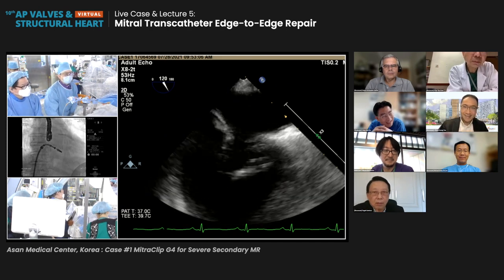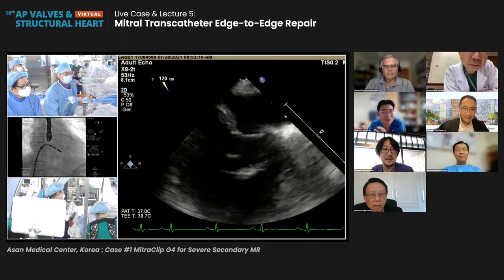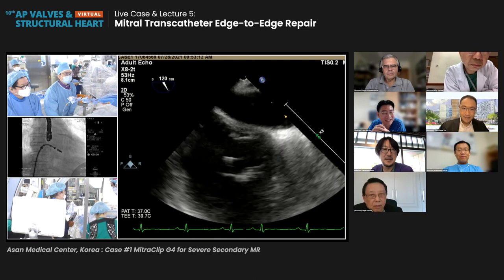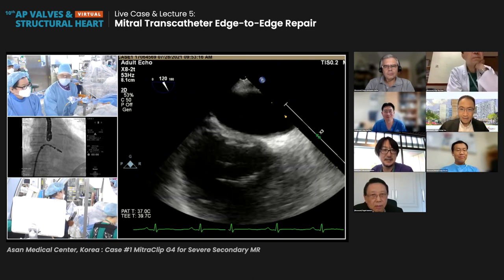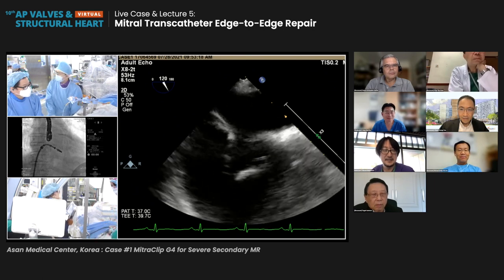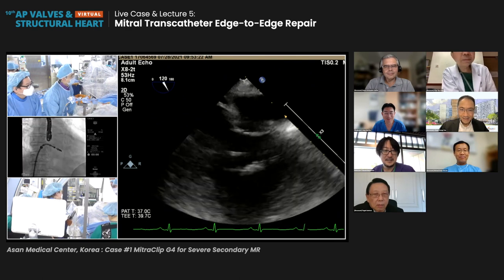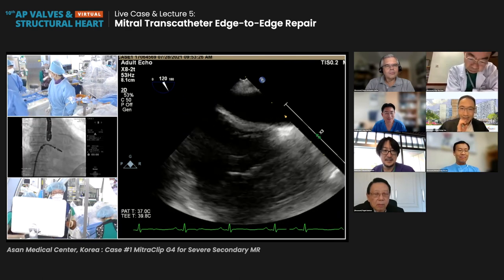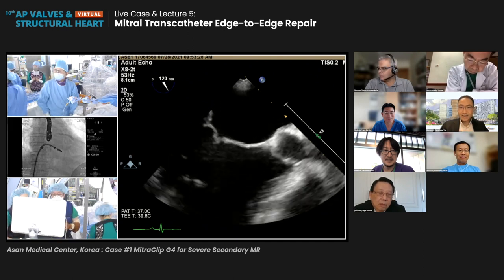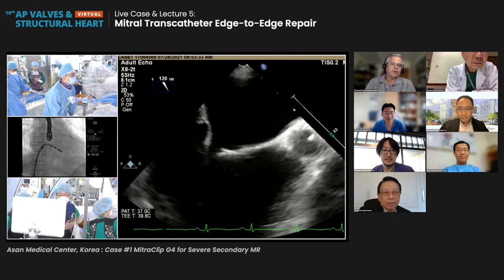How about Dr. Matsumoto? I use XTW rather than NTW. For functional MR, Dr. Matsumoto, I recommend NTW. I think there is slightly more opinion in favor of NTW. Okay, let's choose NTW.